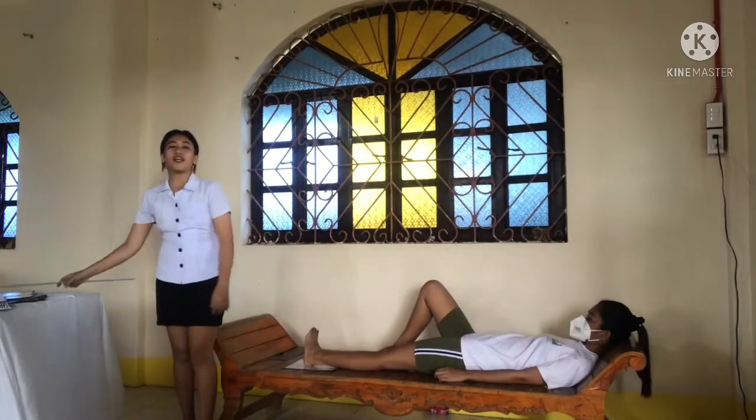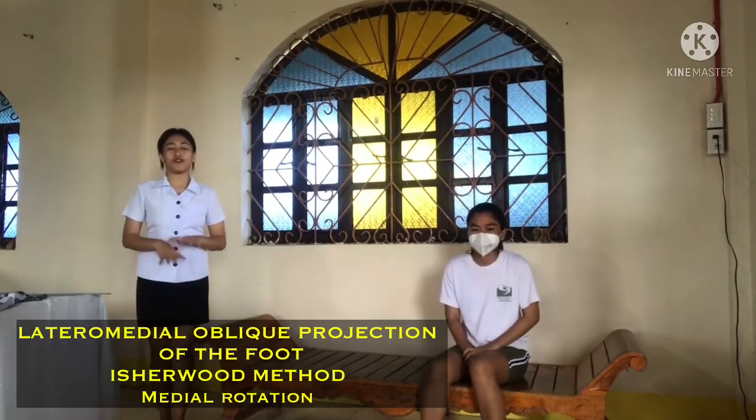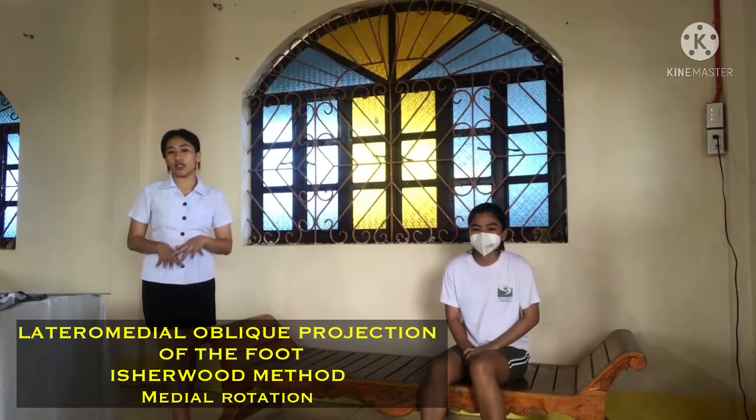So the inter-ankle mortise joint should be demonstrated in profile. The three sides of the mortise joint should be visualized. Next, we have the lateromedial oblique projection of the foot, Isherwood method, medial rotation. So the IR used for this projection must be 8 by 10 inches. So place the patient in seated position, turned away from the side being examined.